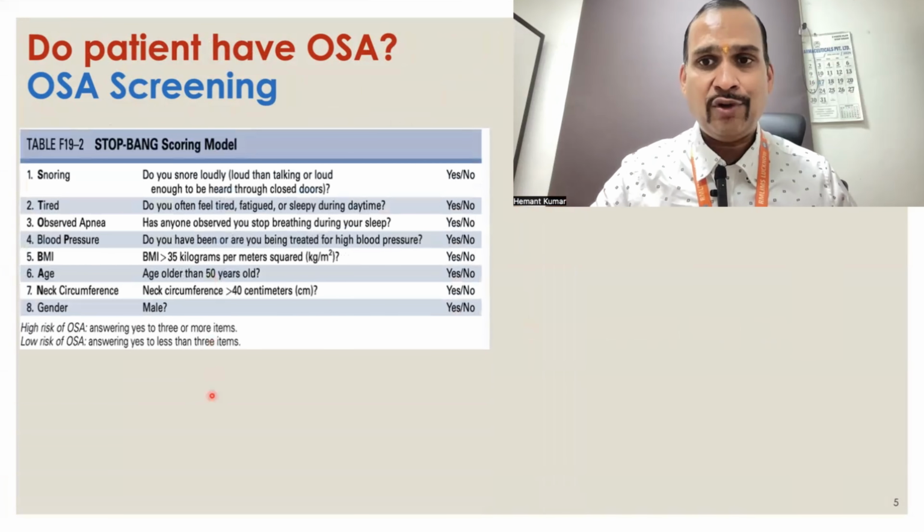For a few patients, especially pediatric patients, a CO2 sensor is mandatory. For heart rate parameters, we have ECG. You all must have seen ECG. By ECG, we are measuring all these heart parameters. EMG for periodic leg movement, and by video, we can identify parasomnia. So these are the sensors or electrodes we require for a complete sleep study.